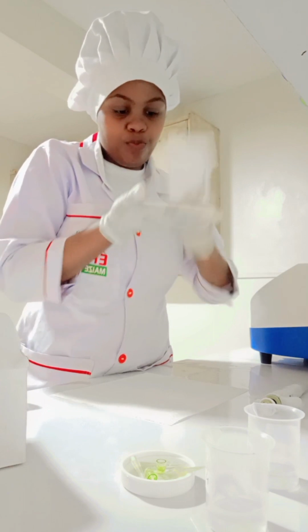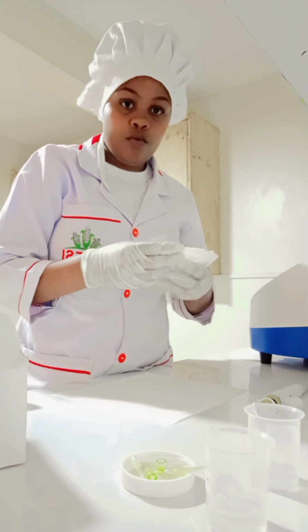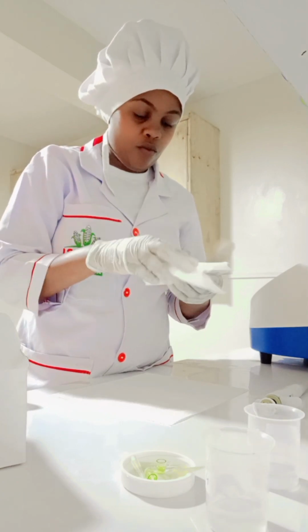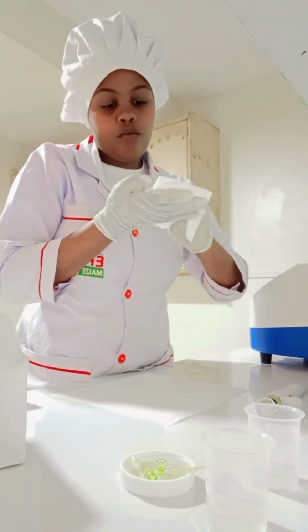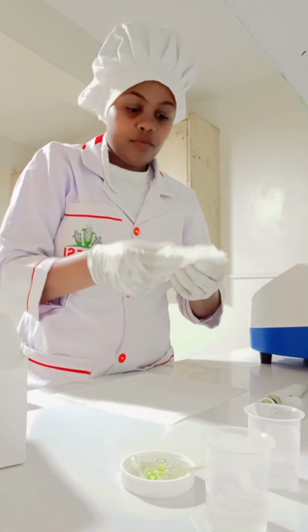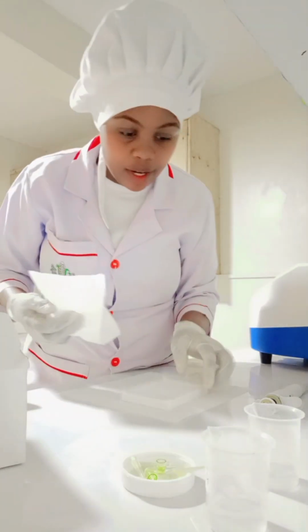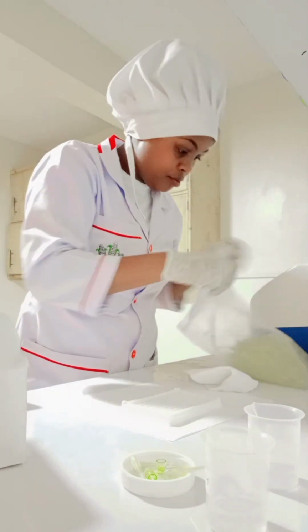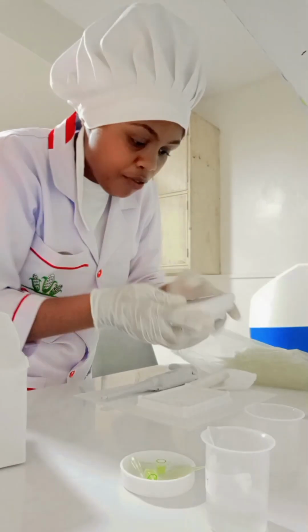After washing, here I was already, because the process requires you to be very fast. Here I was already done with washing. There's a stage, washing stage. There I had already done the washing stage. Now I was drying these wells. I was drying them using this absorbent towel. That's its job, mostly that's its job in the lab. Don't think it's a tissue, that's not a tissue in the lab. It has its own purpose.